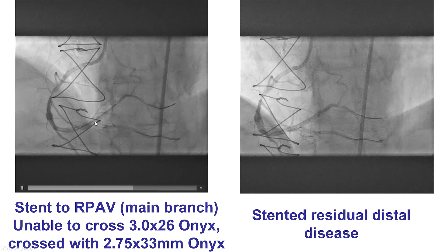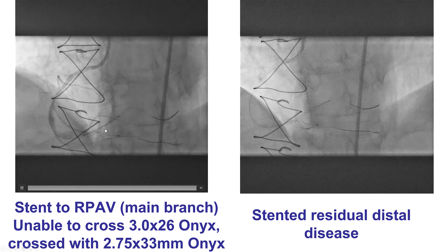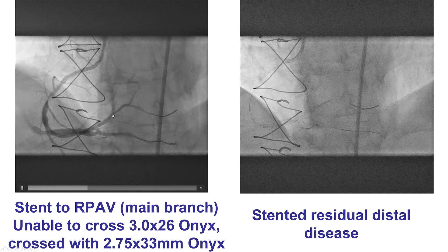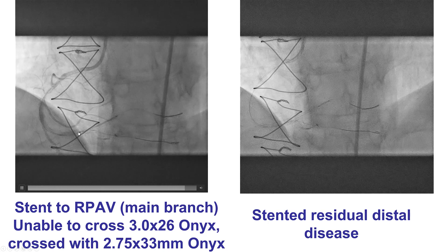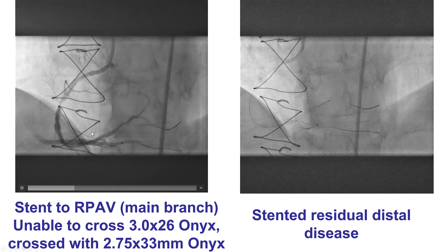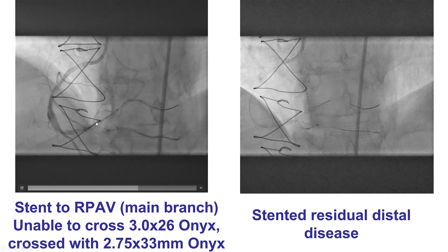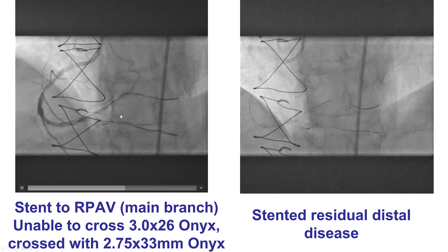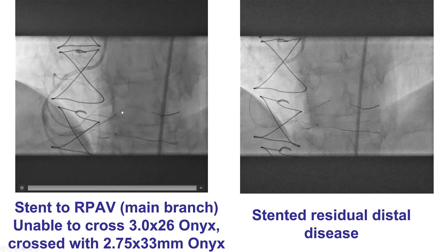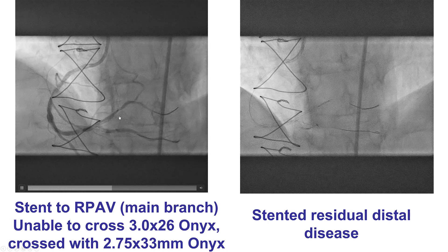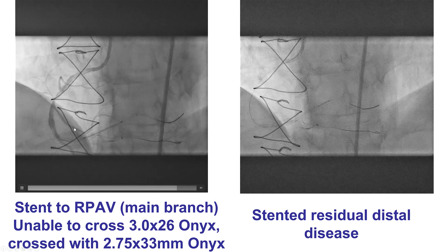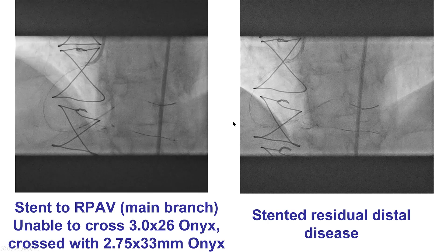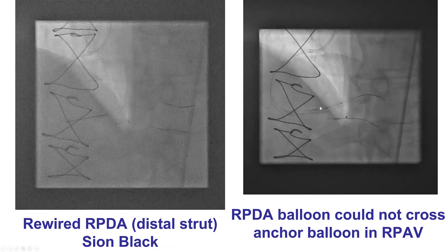After achieving a good result in the PDA, which was the side branch, the next step was to stent the main vessel. The stent protrudes at least 8 mm back from the bifurcation carina to allow for the proximal optimization technique. In this case, we did not optimally choose the stent length and had a small area of uncovered lesion distally. So we deployed the stent, and then before other steps, we placed an additional short stent covering the distal lesion into the right posterior lateral vessel.